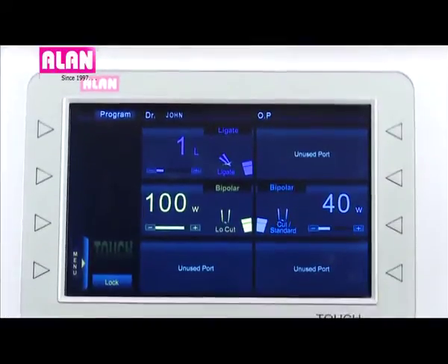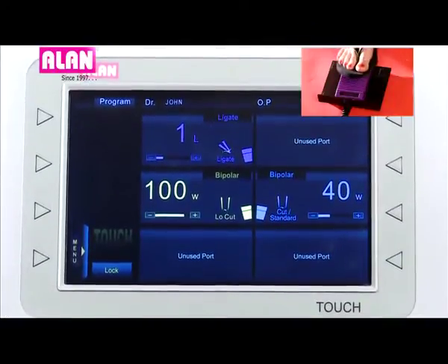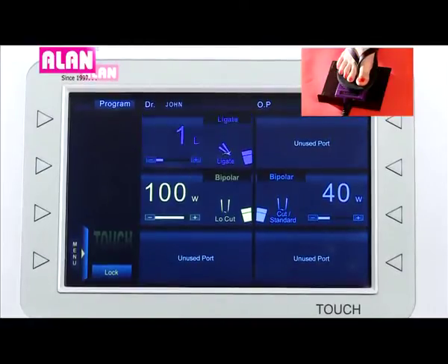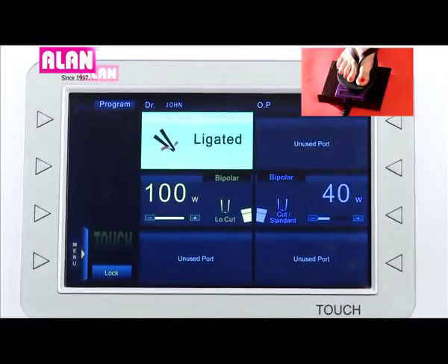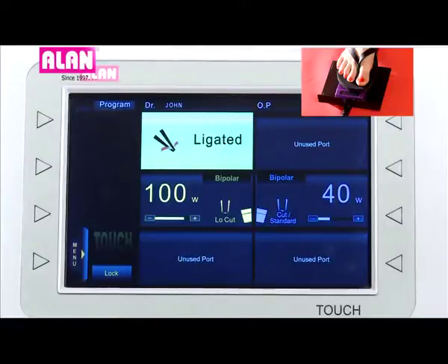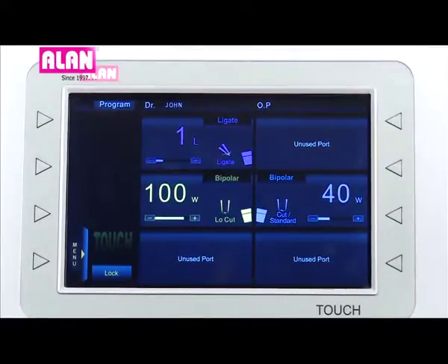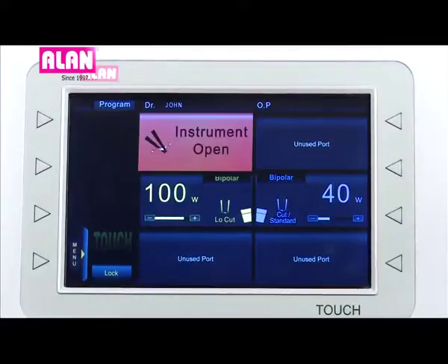If tissue is held properly, the unit delivers the output and displays 'ligated.' If the tissue is not connected to the band properly or the instrument is open, the unit will show an error.